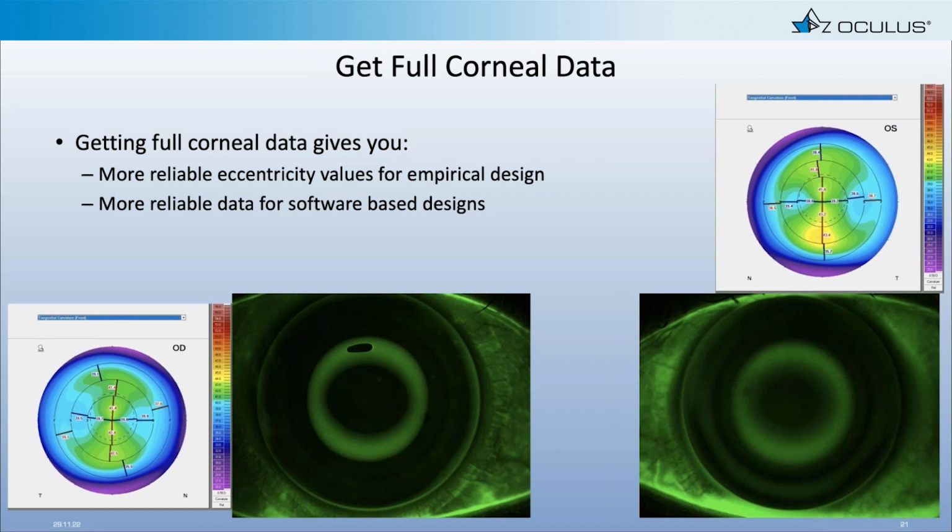So, when you look at these Ortho-K lens fits that you see on the screen in front of you, this is on the same patient. The left picture is the right eye. The right picture there is the left eye. Recognize this patient has about 6 diopters of myopia with 250, 275 of cylinder. This is a very highly myopic, highly astigmatic cornea, and you see what literally look like perfect Ortho-K lens fits on each eye. And you can see the topography there next to the lens picture on each eye.